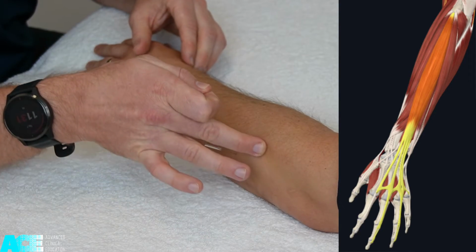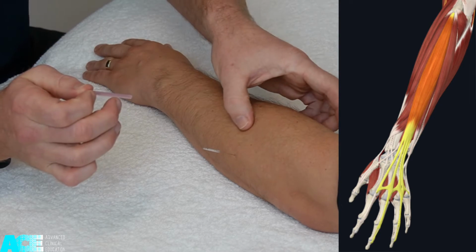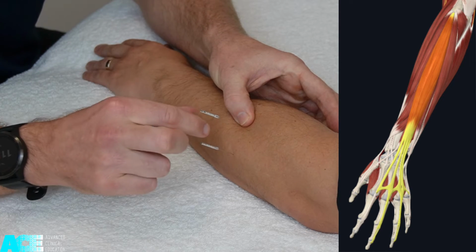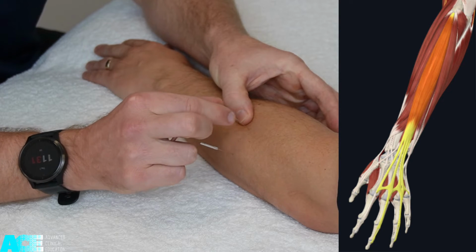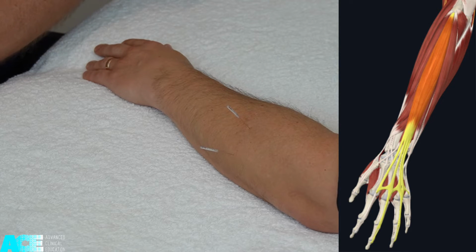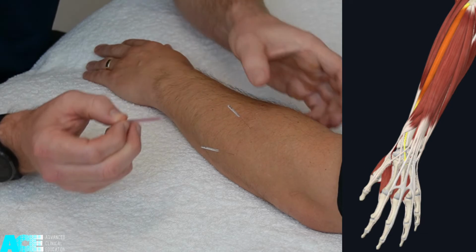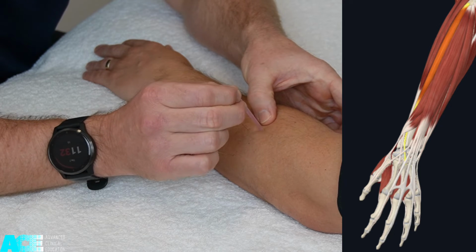Then moving into the extensor digitorum muscle, palpating through the belly of the muscle, and the needling approach is perpendicular to the skin. The extensor carpi radialis brevis muscle can also be needled perpendicular to the skin.